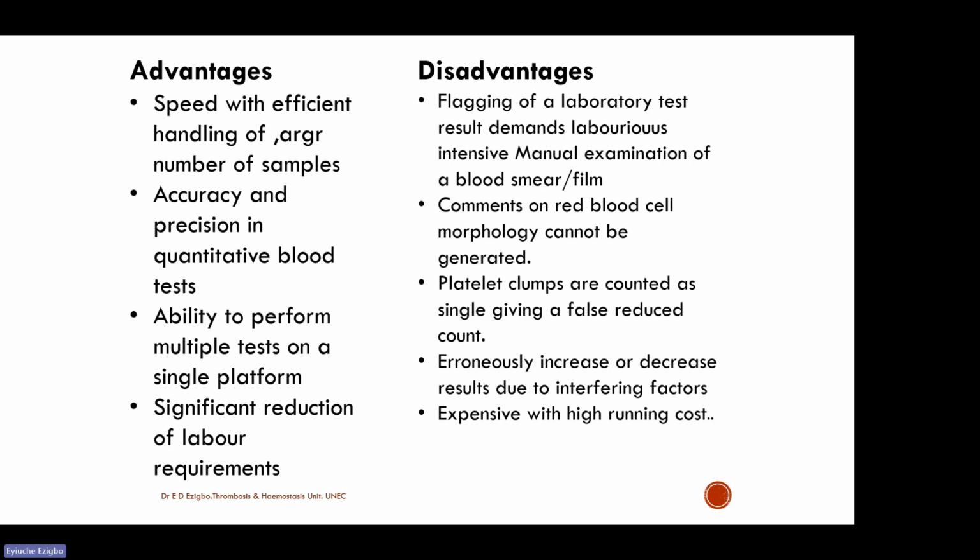When you look under the microscope and count the cells with your eyes, you find that definitely you must miss one. If you want to try it, let one person count a sample for white blood cells and give another person the same sample to count at the same time, maybe in a different lab. You find that they can never come up with the same results. They may be too far apart depending on the human errors that were introduced.